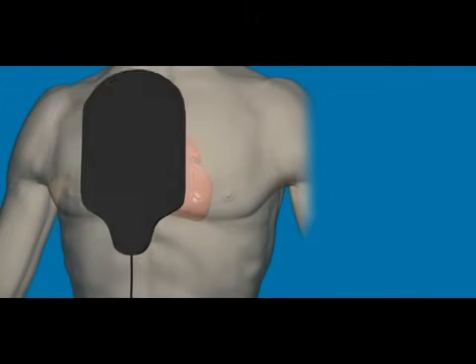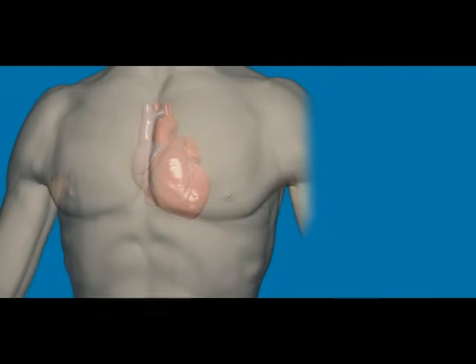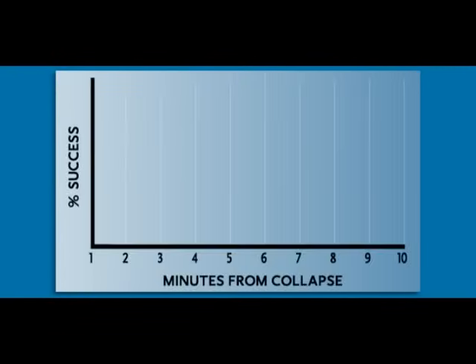The longer they stay in this condition, the lower the chances are that they can be revived. The only way to stop ventricular fibrillation is with a controlled shock to cause the heart to restart in a regular rhythm. That's called defibrillation. Defibrillation is most likely to succeed if the patient is shocked within about the first 4 minutes after collapse. Here's why. When the heart stops pumping blood, the heart, brain, and other vital organs stop getting the oxygen they need. The odds of restarting the heart are going down about 10% every minute.